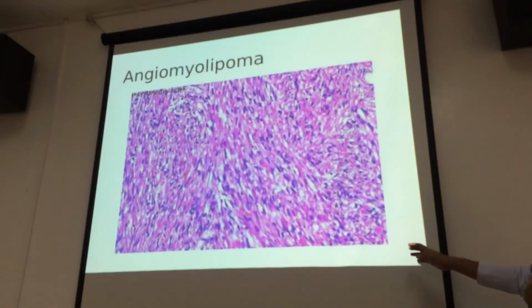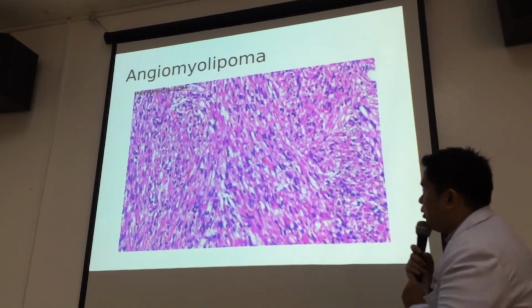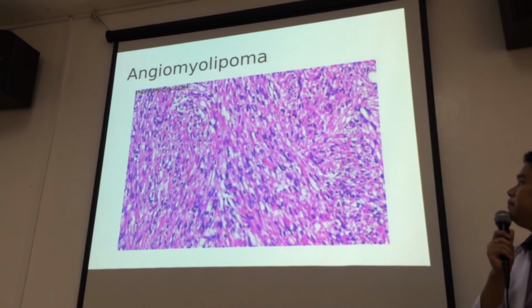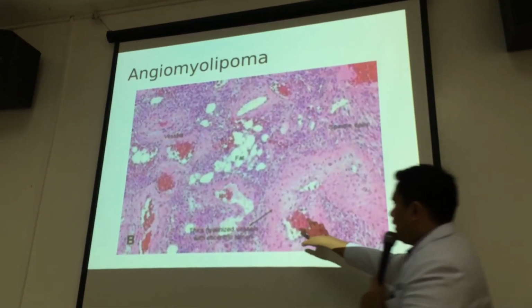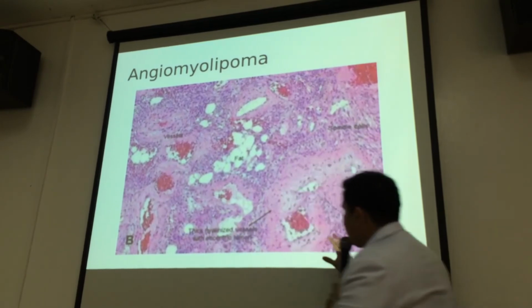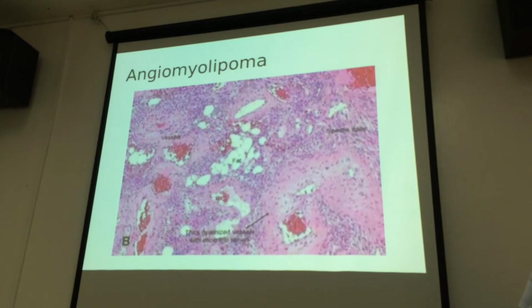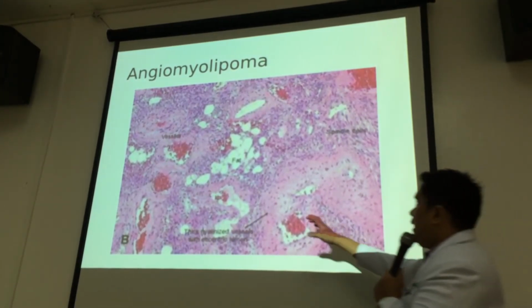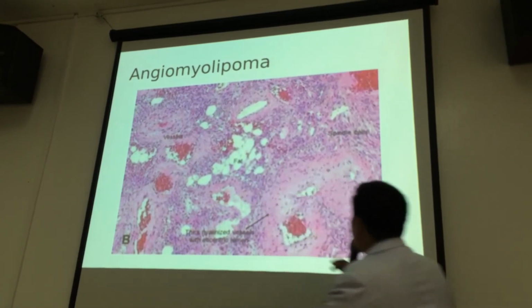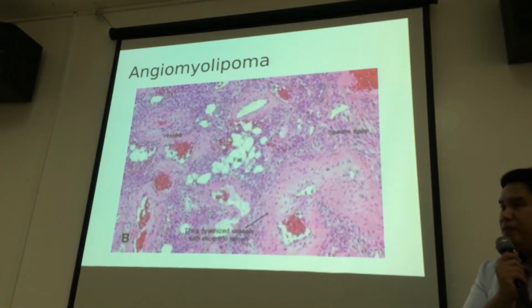This is a tumor, an angiomyolipoma, where the myomatous component, the smooth muscle component, is more prominent. And an angiomyolipoma where the vascular component is more prominent. And this one, surgeons are very keen on excising because of its very bloody aspect. You can still see islands of fat here, fat globules. So angiomyolipoma. This is a benign tumor.